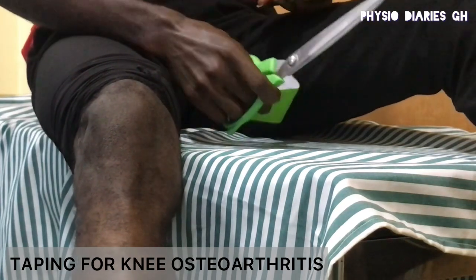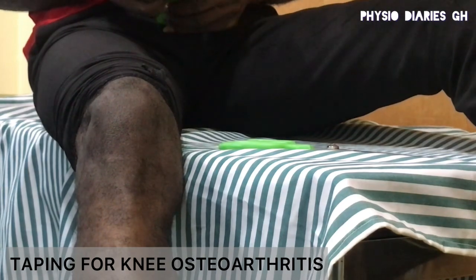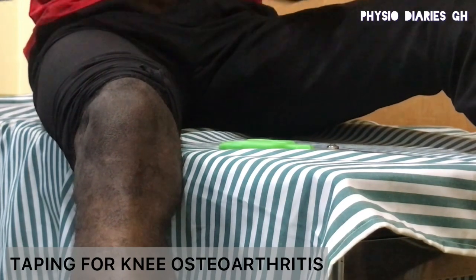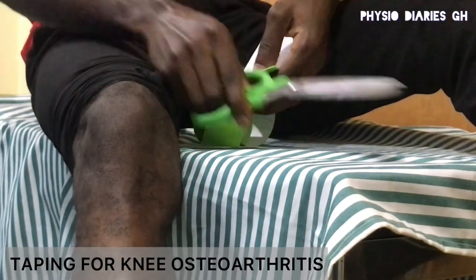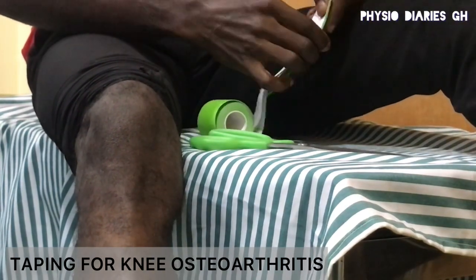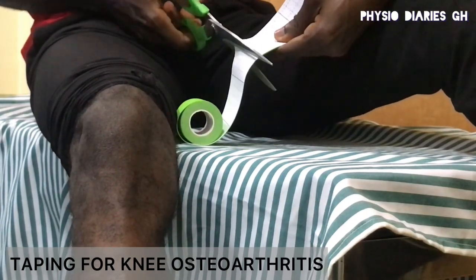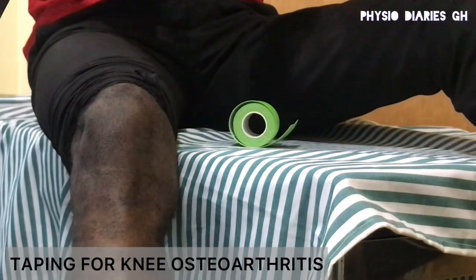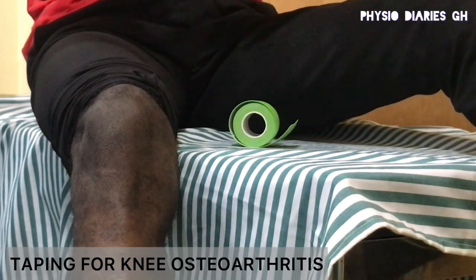Remember, we are going to use 3 of them, so cut additional 2 strips with the same length like the first strip. When you are done, put all the strips together and shape the edges to look nicer.